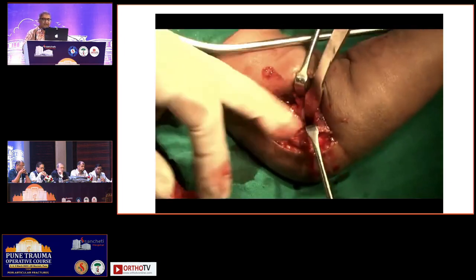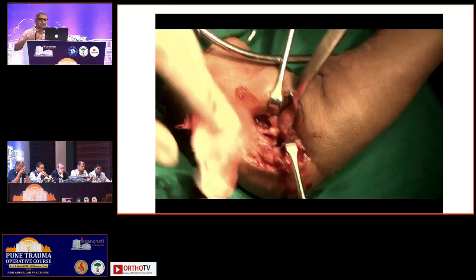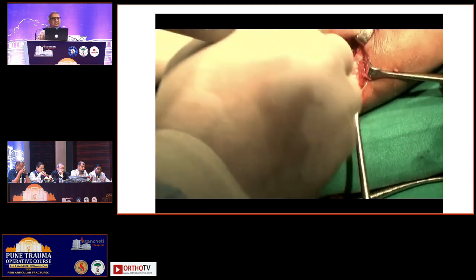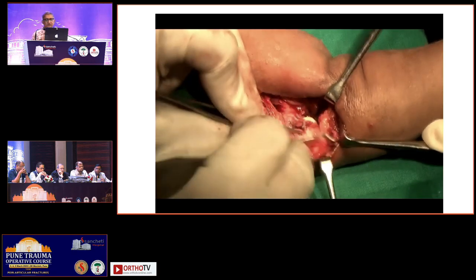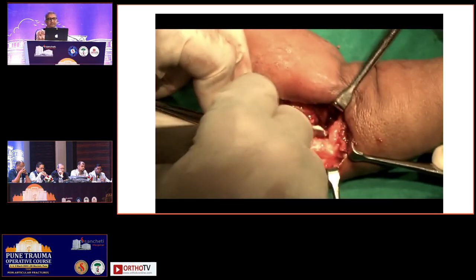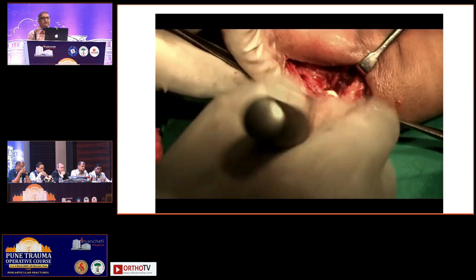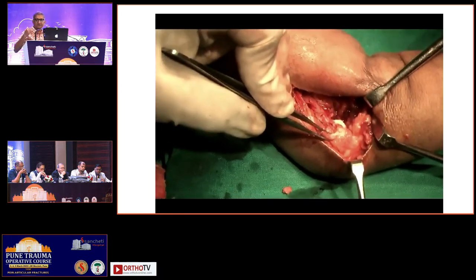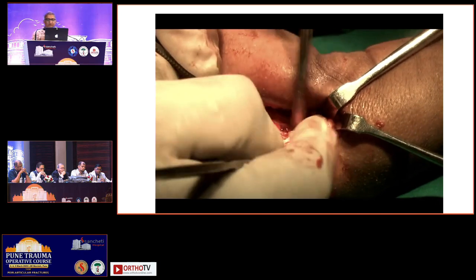The fractured fragment, you have to dissect through the fracture. You have to go through the fracture and mobilize it and reposition it. You should not touch the muscle attachments which come from the posterior aspect, otherwise you will cause avascular necrosis. So you are seeing that with the help of a fine periosteum elevator, I am dissecting at the fracture line and mobilizing through the fracture. And once you do that, you will be able to mobilize the fracture.